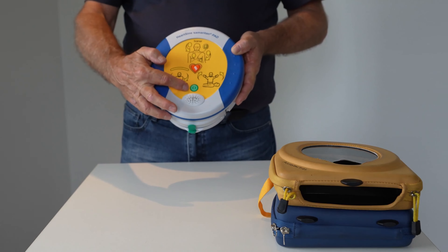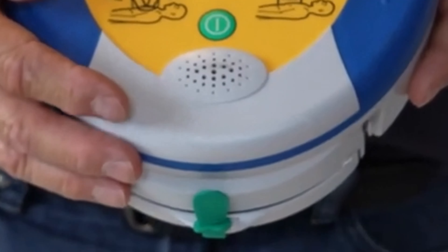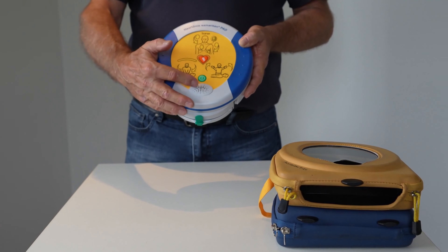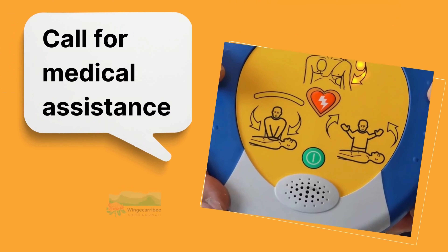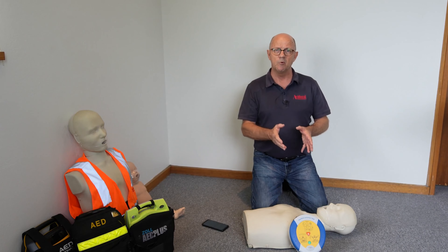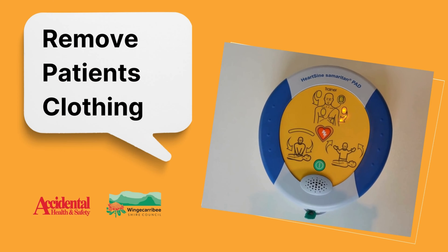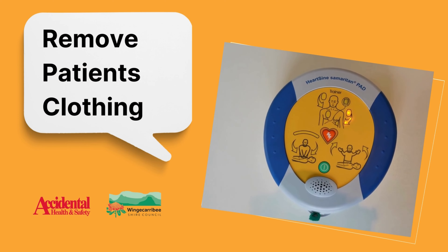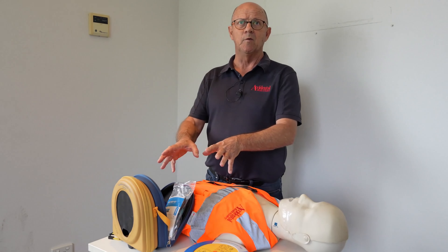When we press the start button we'll also get a voice helping us through the process. Why don't we just start it and see what it sounds like. When prompted to call triple zero, we need to do that immediately — we may even get someone to help us with that. It is critical that we get emergency services to help us save this patient.